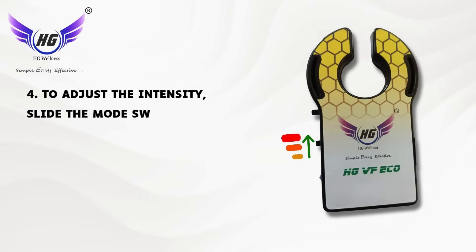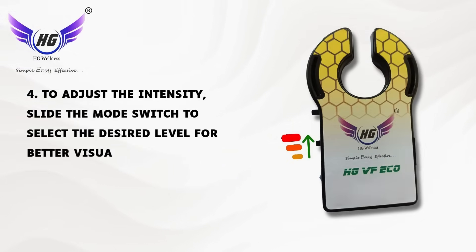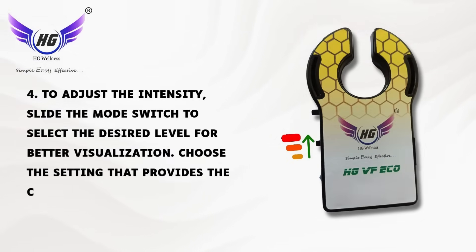Fourth, to adjust the intensity, slide the mode switch to select the desired level for better visualization. Choose the setting that provides the clearest view of the veins.